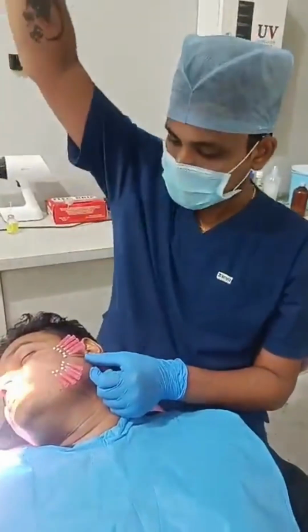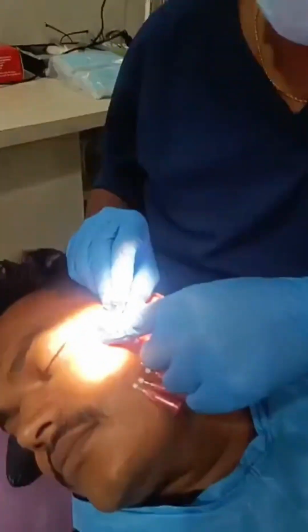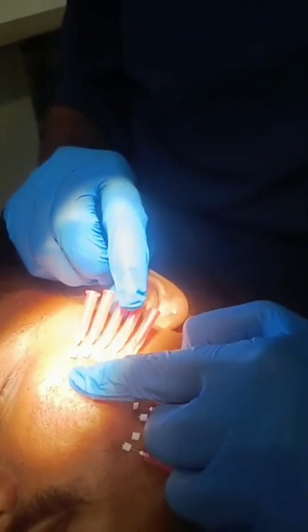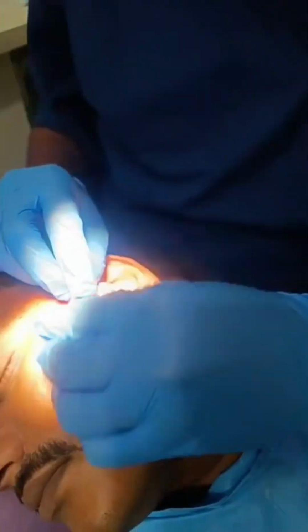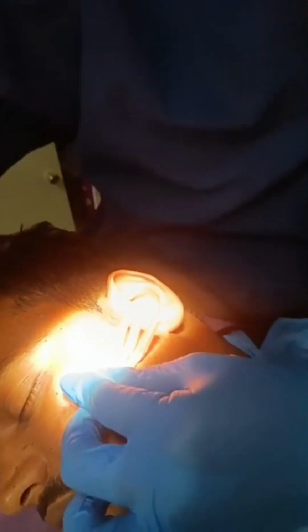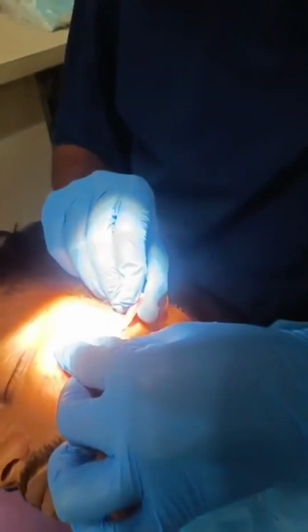Now after doing this, how to remove the needles? You need to rotate the needle in a 360 degree direction. Hold it here and rotate it 360 degrees. Hold it and rotate again 360. Hold it and rotate again 360 degrees. Then remove either 2 or 3 needles at a time. Just apply cotton there. See, there is no thread coming with the needle. Just rotate it 360 degrees and then remove it.